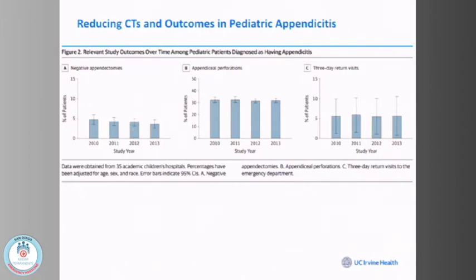So who does the ultrasound for appendicitis? Do I do it? Yeah, I'll give it a crack. I'll spend 3, maybe 4 minutes until I don't see the appendix, and then I walk away and I order one from radiology. If I find the appendix, I record the whole thing on video, save some still images, measure it all out, show my surgeons.